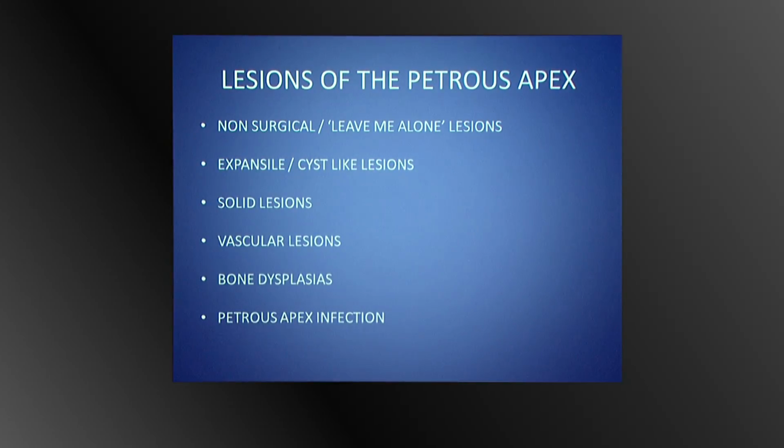This is a homegrown one, and it's probably as imperfect as the others, but I think it works quite well, and it's not as daunting as it first looks, because if you look at the list, the first point, as I've already said, is decide is it surgical or non-surgical, and that's a really easy differentiation, which I'll show you.